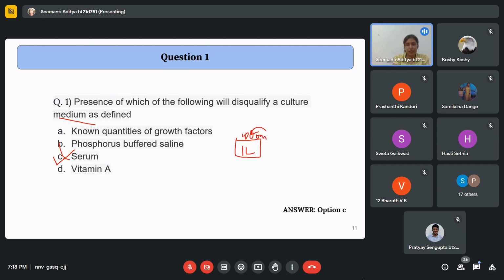If we are adding fetal bovine serum, it comes in a separate bottle. From the 1,000 ml of the DMEM that we are preparing, we take out 100 ml of DMEM and add 100 ml of FBS, so 100 ml of FBS added to 900 ml of DMEM. That media now becomes media that contains FBS.